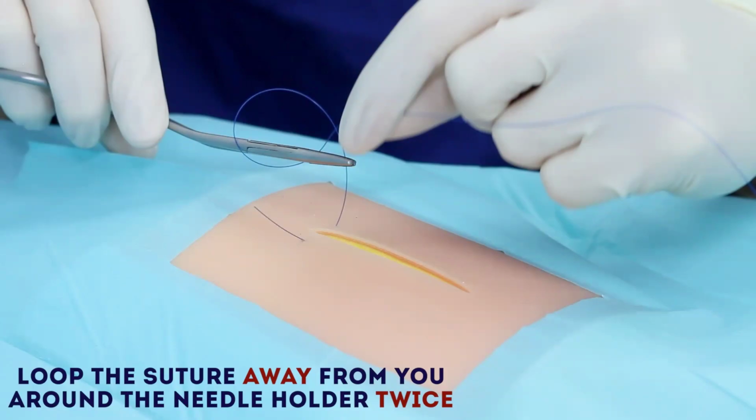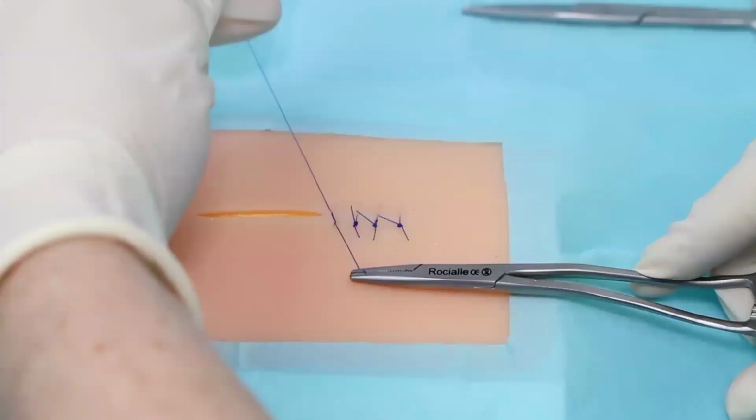The knot should be in the middle of the wound. Okay, so I'll do another suture. I'll continue this, and nurse, you will cut it. And we'll do these interrupted sutures, and after that, nurse, you can put adhesive tape.